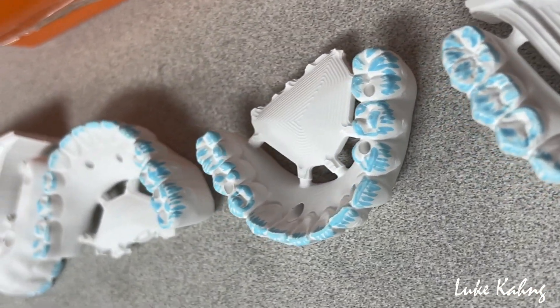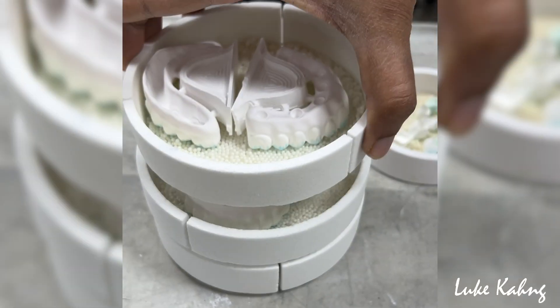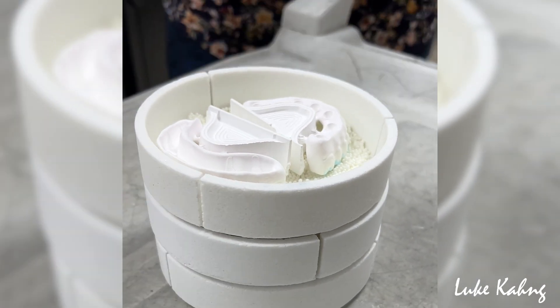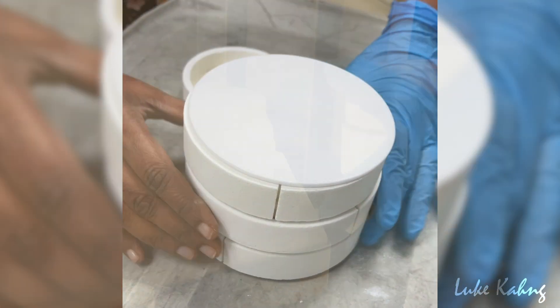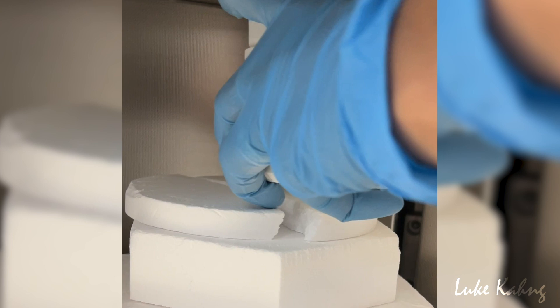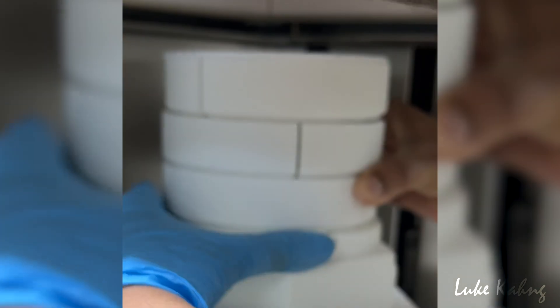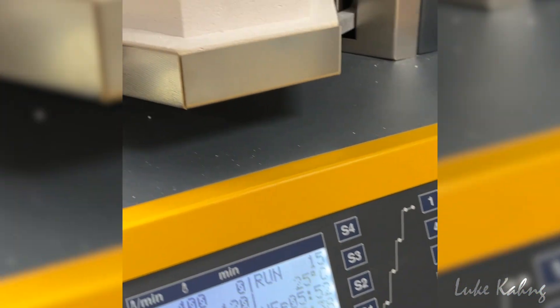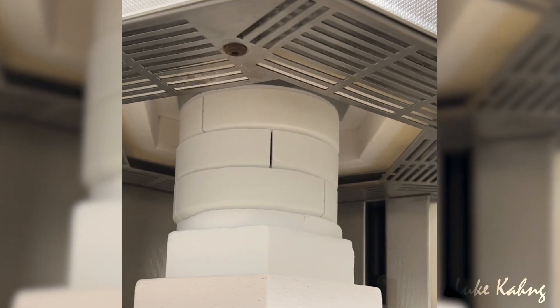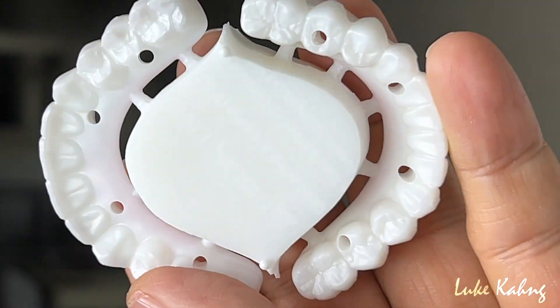Once milled, the arches are stained and baked in a dental oven. Here's how they look after the first baking.